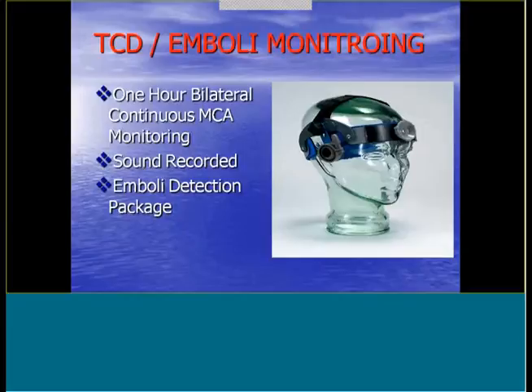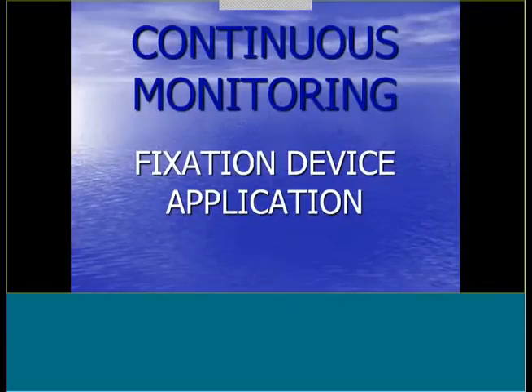Now, fortunately, a lot of the emboli detection packages are very, very sensitive nowadays. It's not like years ago. The sensitivity and specificity for the SONARA, I believe it's like 94%, which is really good for identifying emboli. So the emboli detection packages, they're pretty sensitive nowadays.